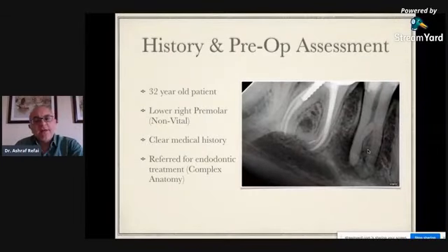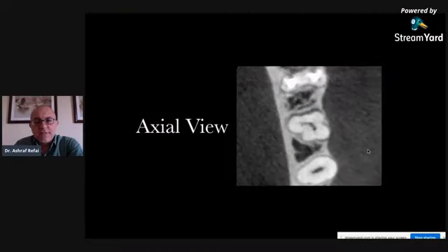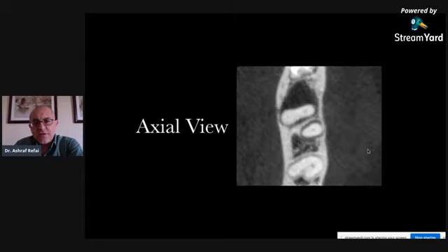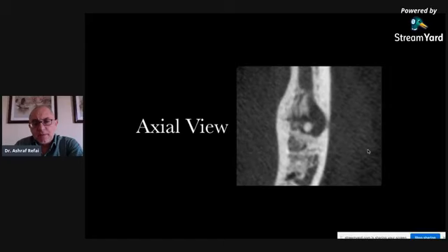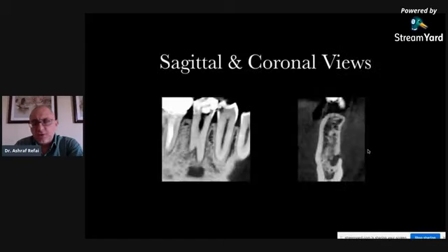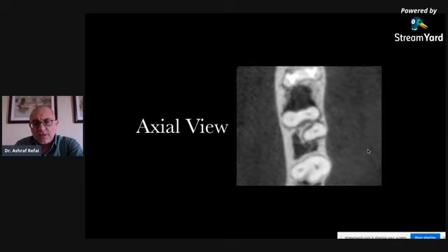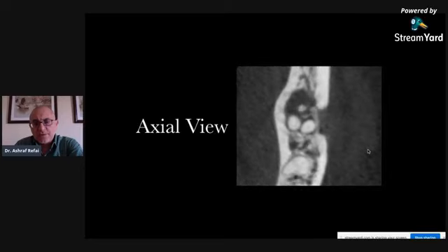So immediately when I get aberrant morphology or something that's out of the normal or the ordinary, I immediately go for a CBCT. And this is the axial view of the CBCT. You can see it moving apically, and you can see there are actually 3 root canals and a lateral lesion. Again, we can look at that. So that's the axial view. I'm going to show it again. There you go. You can see a trifurcation, a separation into three separate root canals.